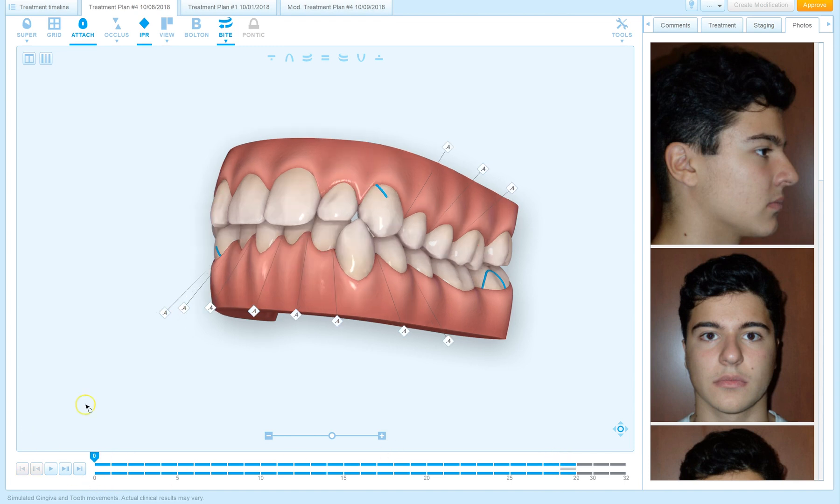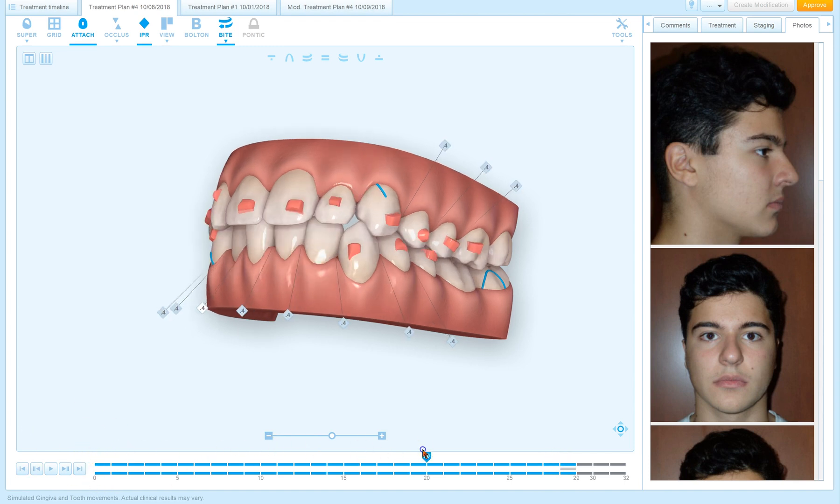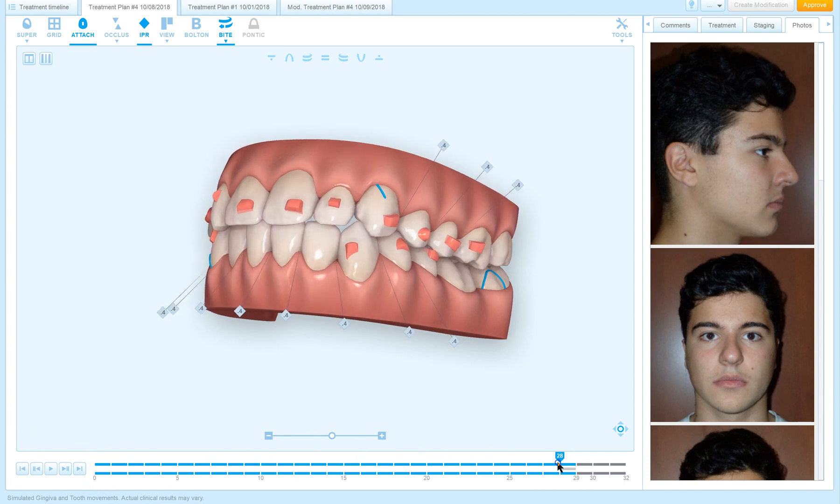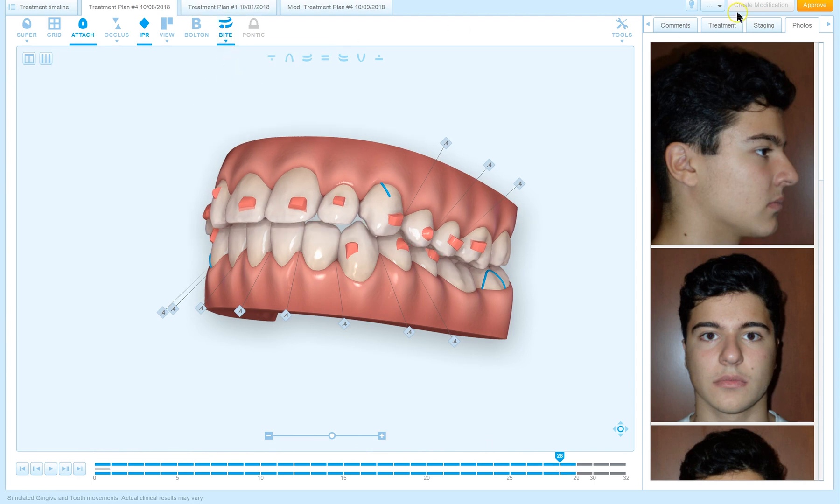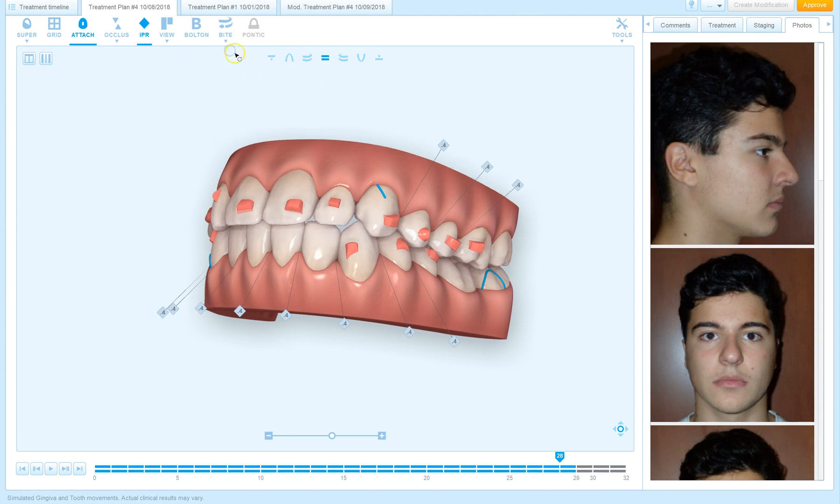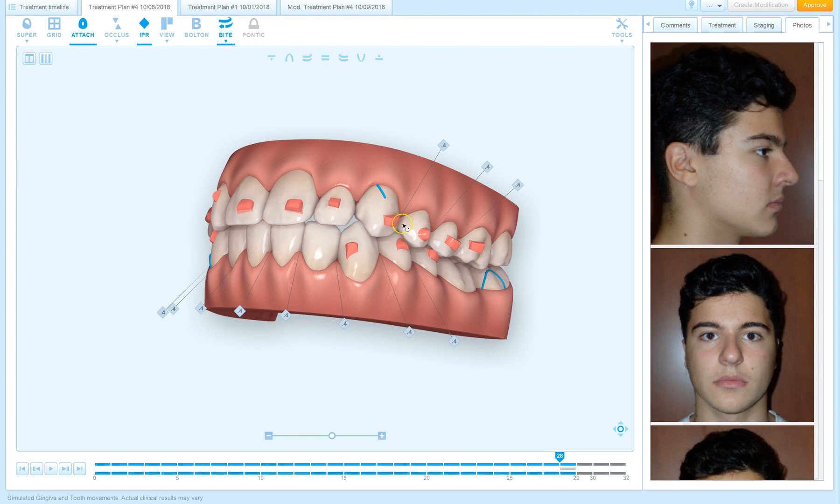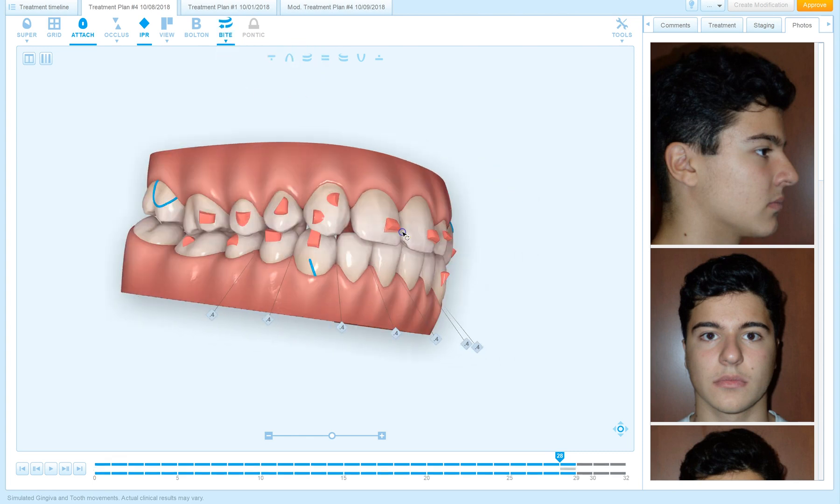So there's a lot to be taught from the ClinCheck, but notice that all of these changes, whether I change the bite jump to at the beginning of treatment, whether I hide it all together, I can still approve my aligners, which means that this is not making any change to the shape of the aligners.